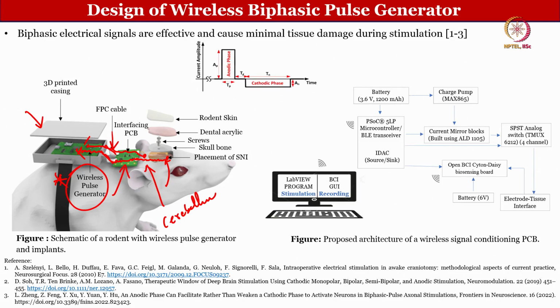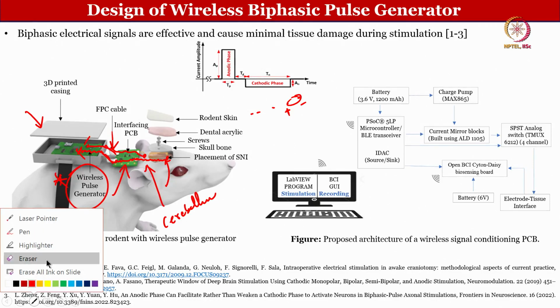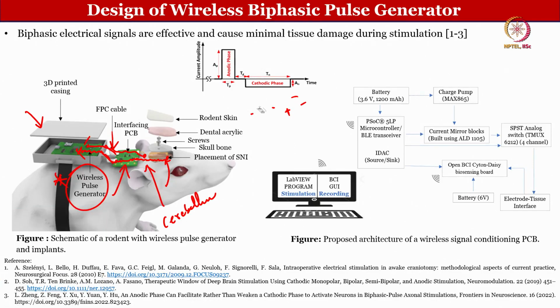What generally people do is they will take 2 electrodes that are present. Now we have 5 electrodes, right, 1, 2, 3, 4, 5. Out of them one they will make active, another one as a ground, and then they stimulate only this particular area. Anything is fine, it does not matter, the concept remains the same, right. For engineers the concept remains the same, the application could be different, right.